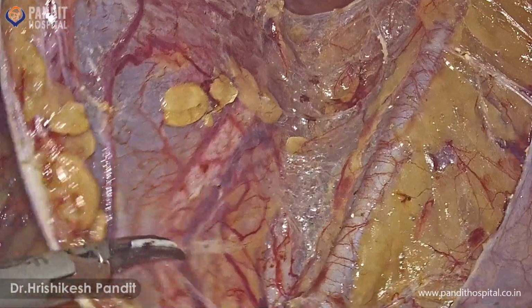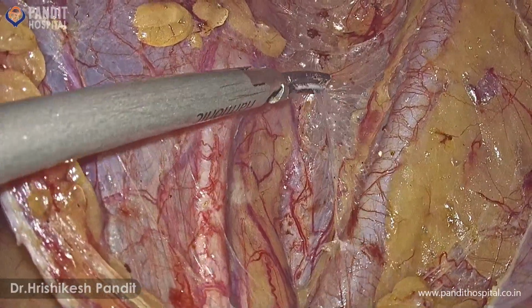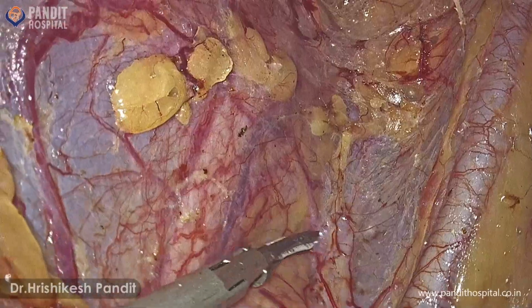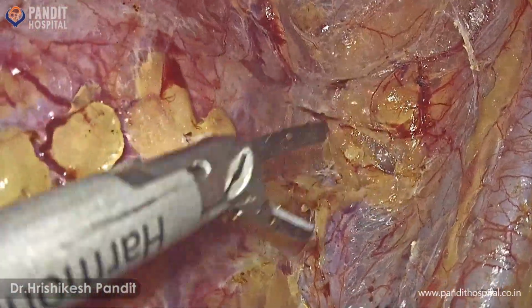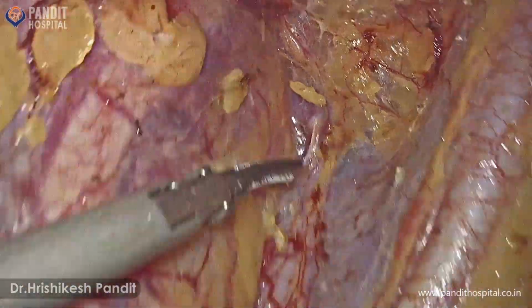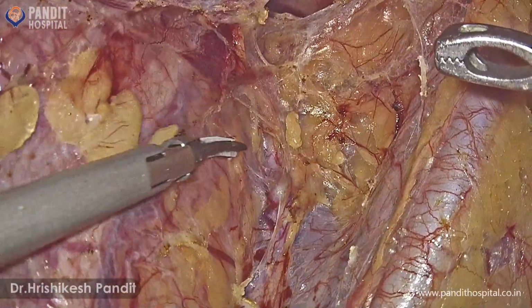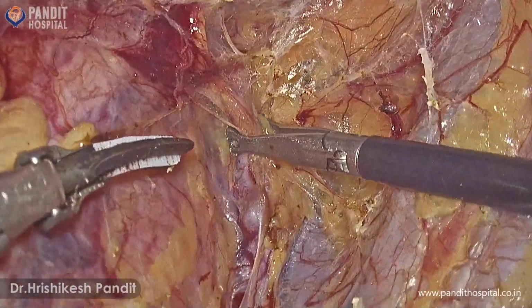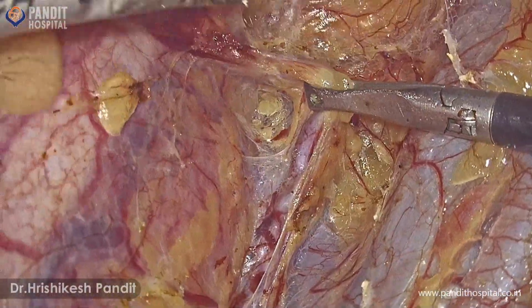Dissection is continued in this space in order to expose the external iliac vein caudal to its corresponding artery and then the internal iliac artery and vein. Careful dissection is done in this space so as to prevent any injury to the great vessels lying along the lateral pelvic wall. We continue to dissect along the internal iliac artery.